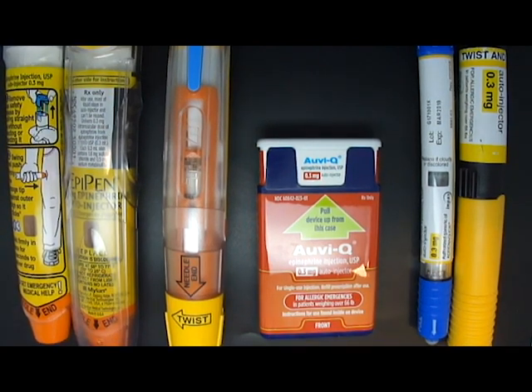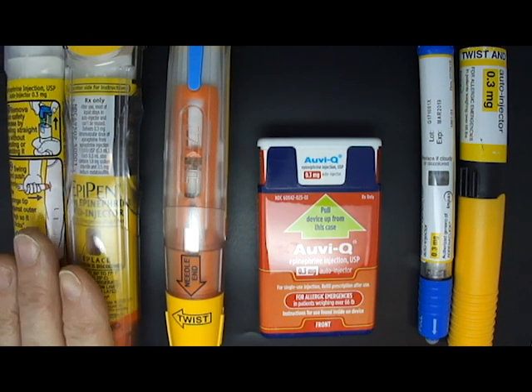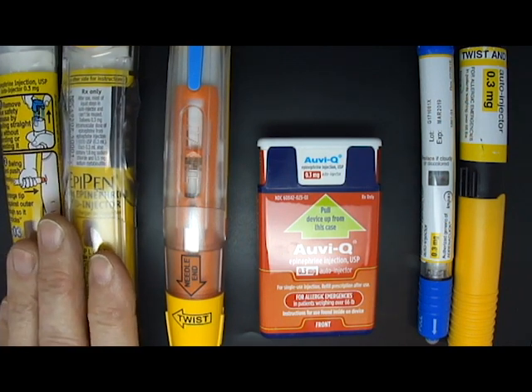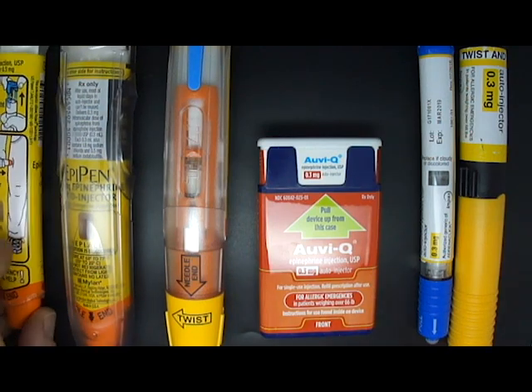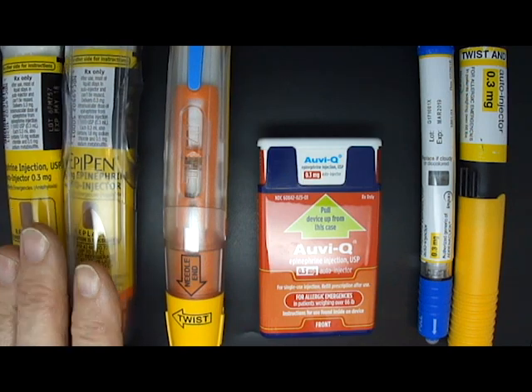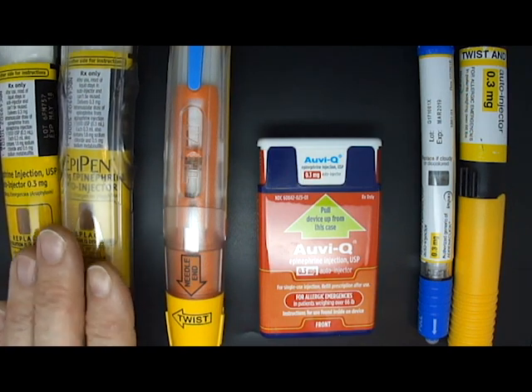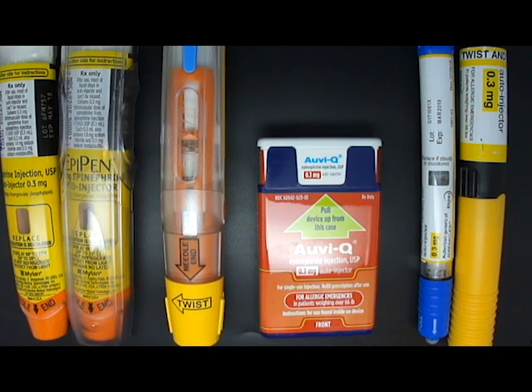Hello, I'm Dr. Julie Brown and I have here the four brands of epinephrine auto-injector that are available in the United States. I have EpiPens, which actually come as both a brand EpiPen and a generic, both of which you see here — but these work identically so we're going to treat those as the same device. I also have a Teva generic, which is a generic for EpiPen.